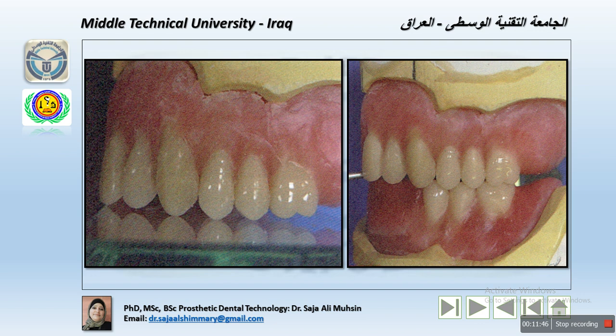as I mentioned previously. Now, the lower molar is positioned in terms of intercuspation with the upper first molar. This way is the best for beginners with the setting of teeth, in terms of controlling the position and the setting of each tooth.